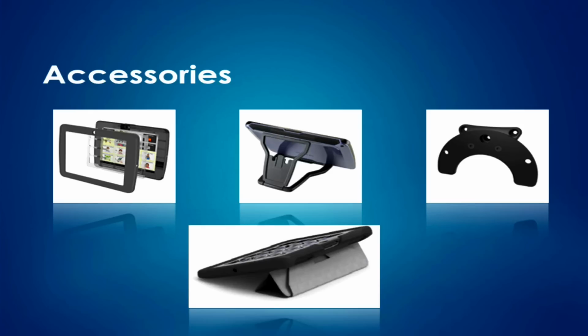There is a stand. You can see that in the next picture along. But if you put the handle on that comes with the T10, that also provides a little bit of elevation as well, not quite so much as the stand. So that's an option. There are also some mounting plates for DAISY and for Connect. So if you do need to mount it to a wheelchair or desktop stand, you could do that with those mounting kits. And there's also a user accessible case, which is pictured at the bottom there.